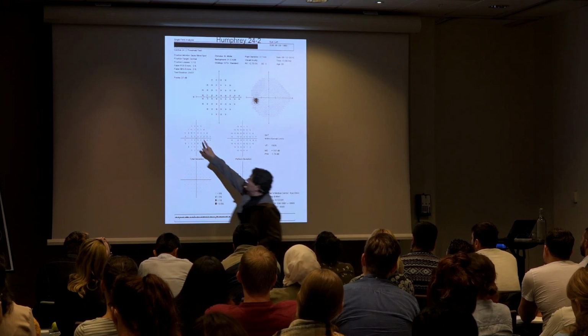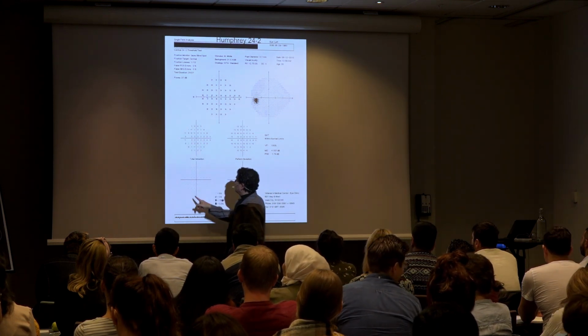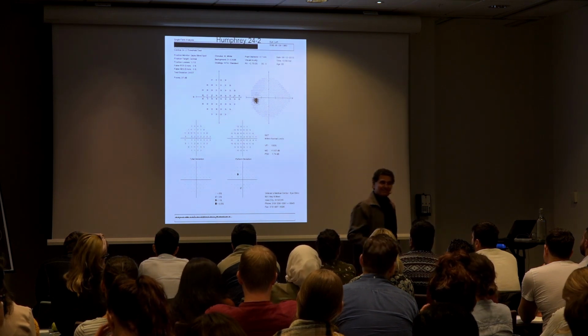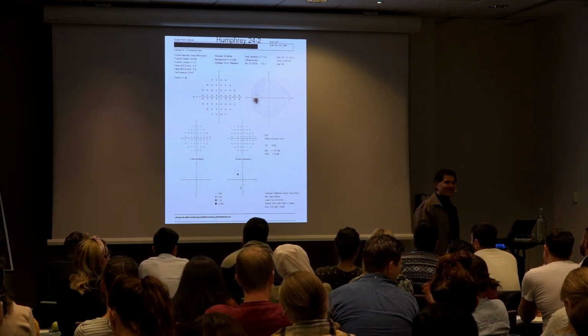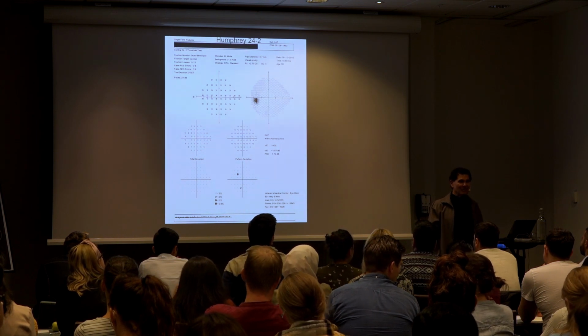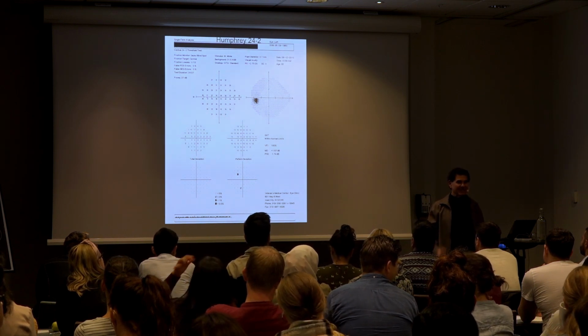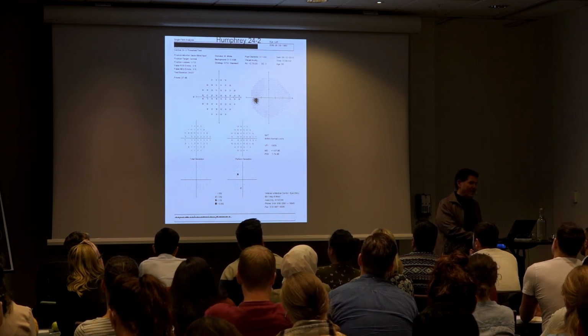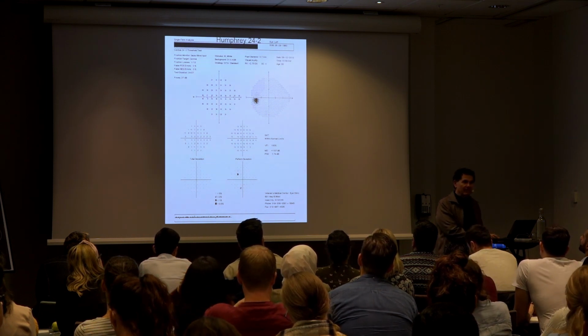You see, it still didn't reach a probability, but I'm just saying that sometimes when it's an early effect, you kind of blow it off. You don't really see it. So it takes two things, maybe structure and function, to call your attention to it. So that was, I think, a good learning point.